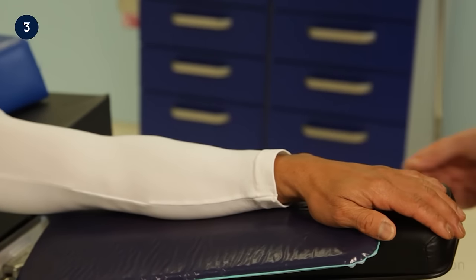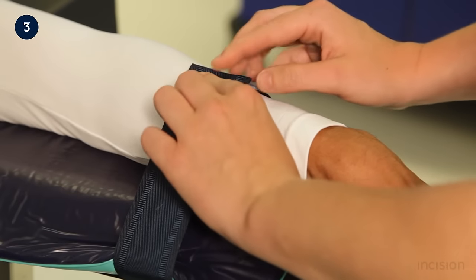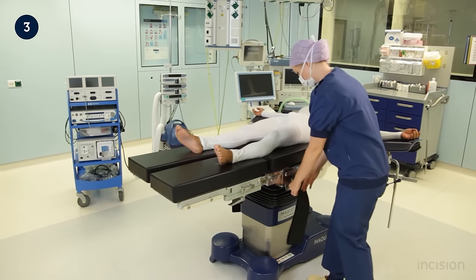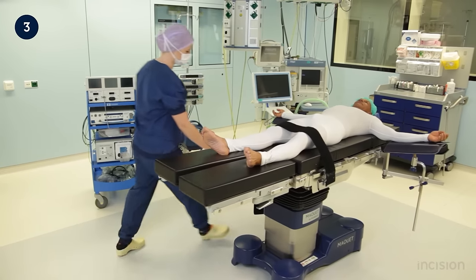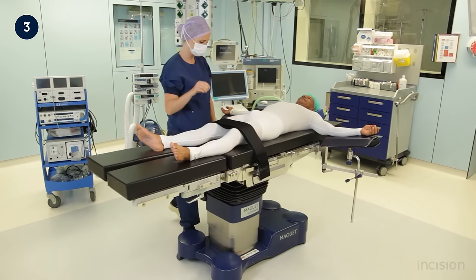With the patient in supine position and the arm supported, additional accessories can be added to the table depending on the procedure to be performed. Arm straps may be used to secure the patient's arm to the arm support. Leg straps may be required to fixate the patient's legs to the table. Note how the straps are positioned proximal to the patient's knees in order to prevent flexing of the joints, especially during emergence from anaesthesia. The safety straps are also used to prevent the patient from slipping from the table when its orientation is changed during surgery.